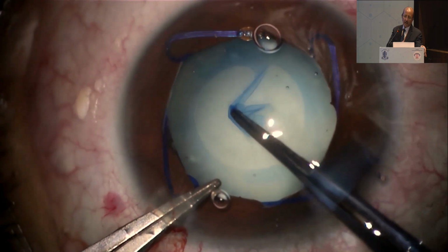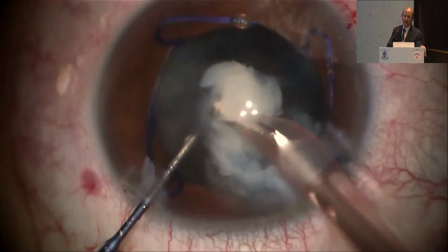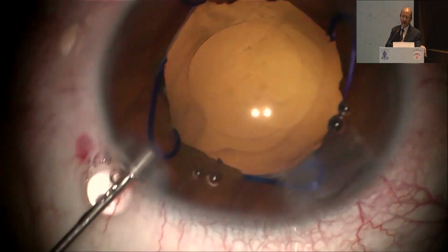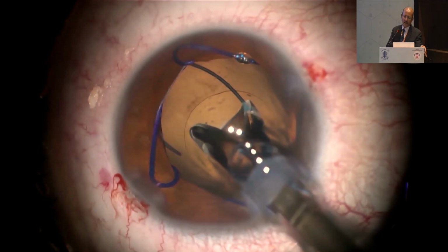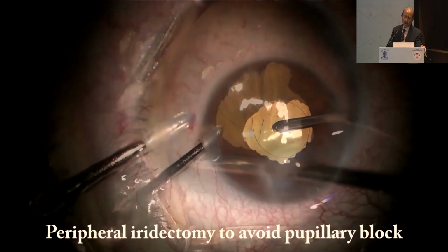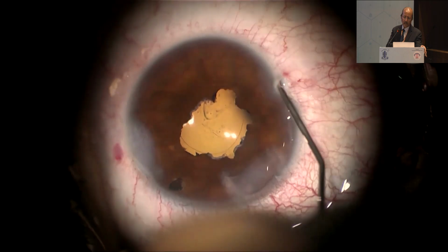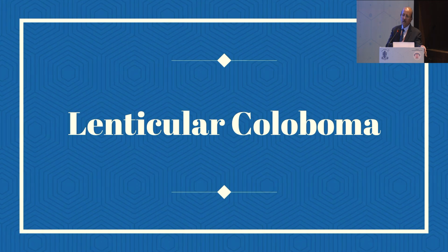Staining was done, and this is the continuous curvilinear capsulorhexis. This is phacoaspiration. You can actually do it with the IA also. And here is placement of the IOL in the capsular bag. And sometimes in such patients where there is 360-degree posterior synechiae, we do a small peripheral iridectomy, not in every case.